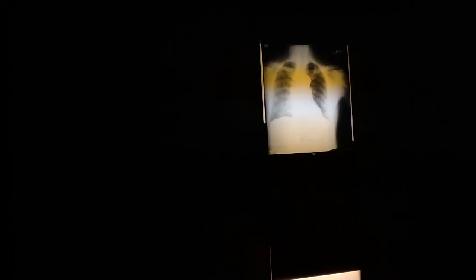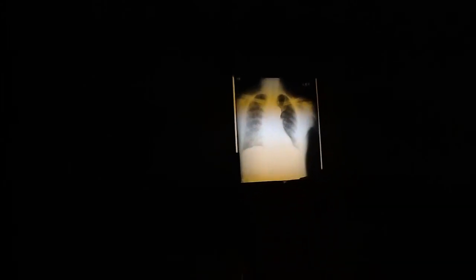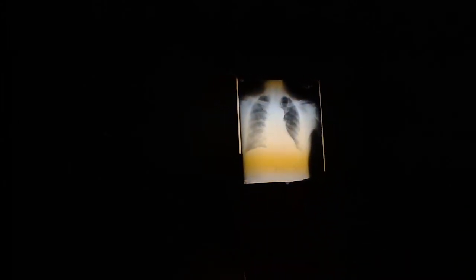If we were looking at an osteosarcoma in the femur, you don't even need a history. The thing is so classic looking. Who needs a history? Miliary interstitial pattern? We're dead in the water without a history. We don't know anything. And then sometimes you can't do much more than say, all right, here are some things that'll do it.